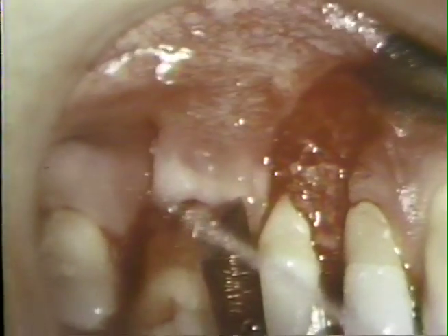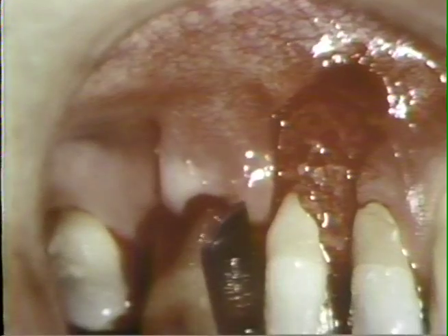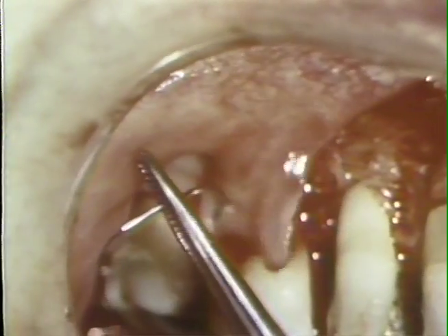The flap is positioned over the root. Its distal corner is sutured to the mesial aspect of the gingiva on the distal root and tied.